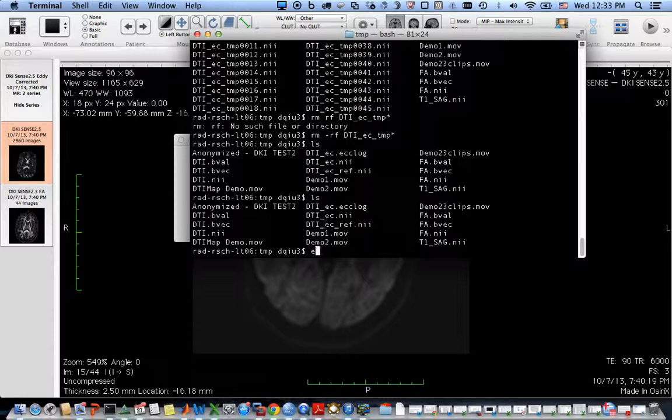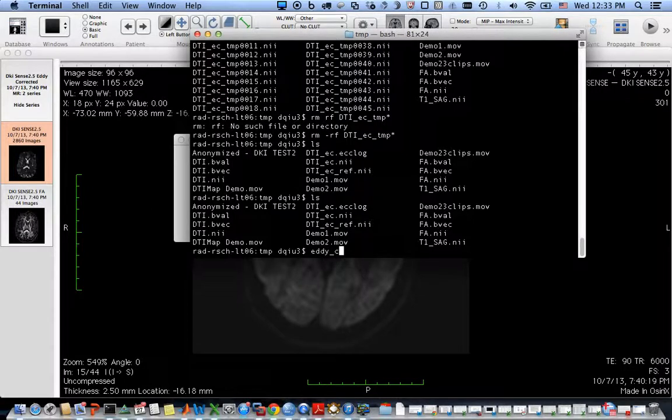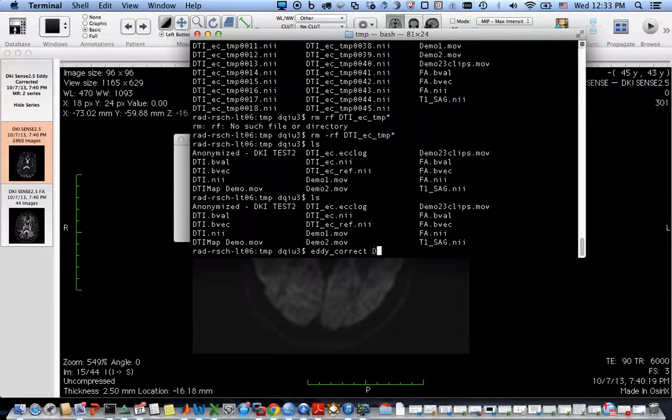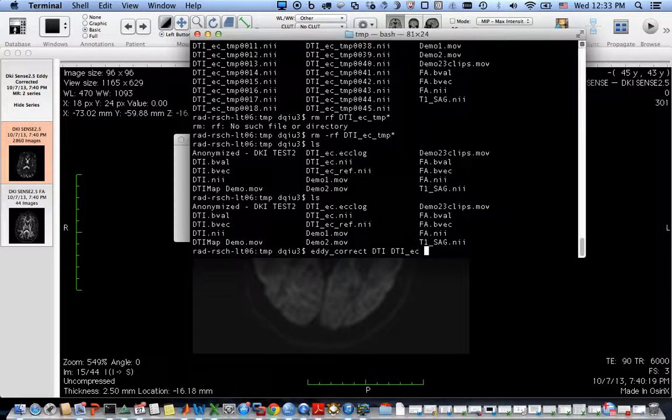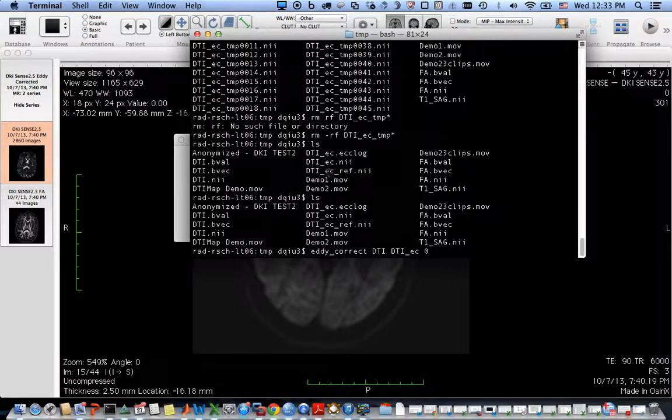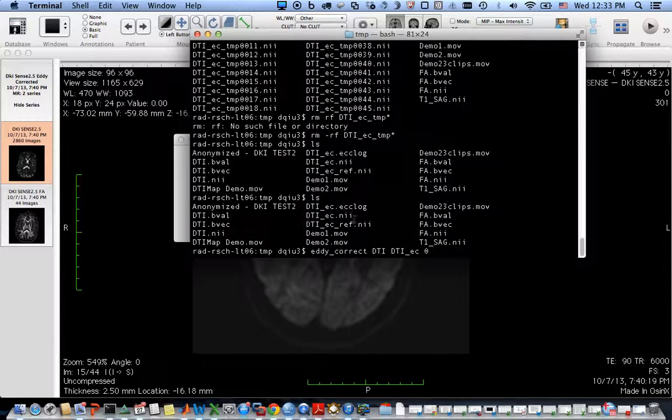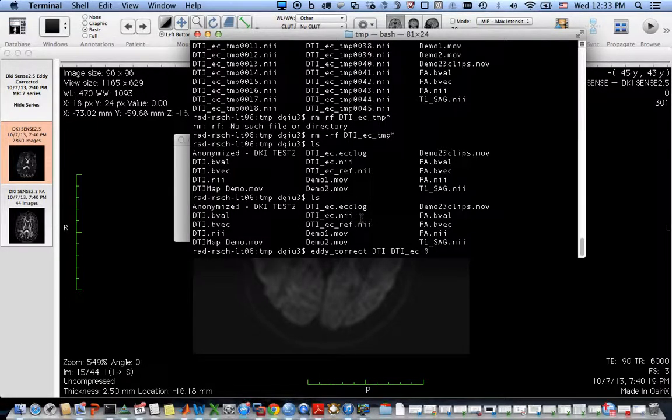Now I want to use the eddy current correction tool from FSL. This is the output name and this is the reference. Because this takes a while, I have pre-processed images and the output will be here. It's DTI underscore EC.nii.